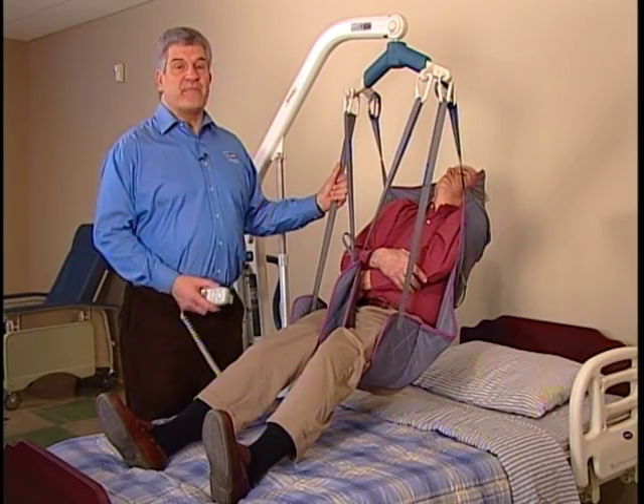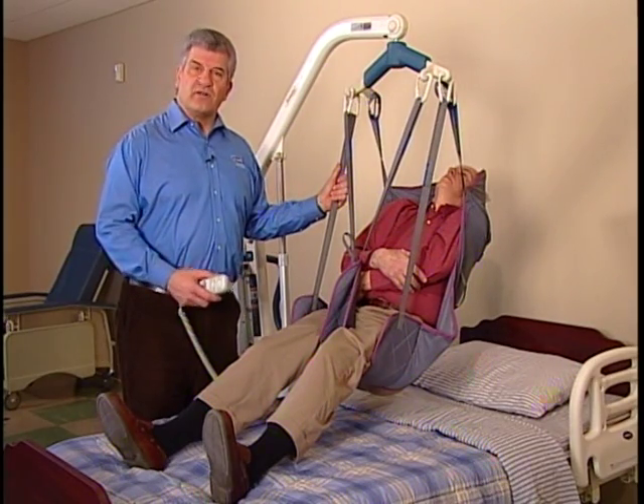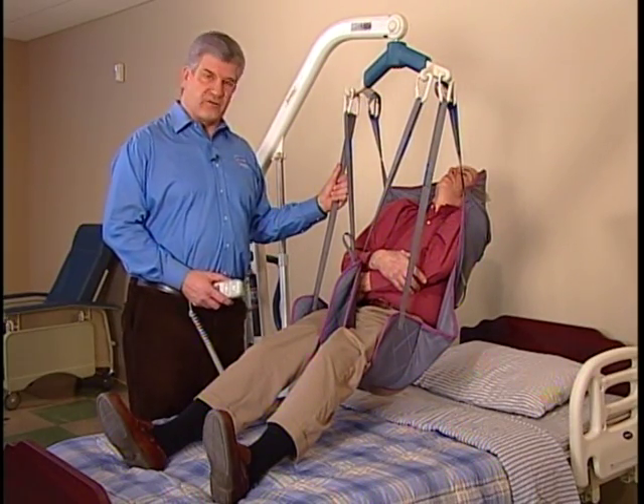If you explain each step as you work through it, your resident will learn the routine and become comfortable with it.